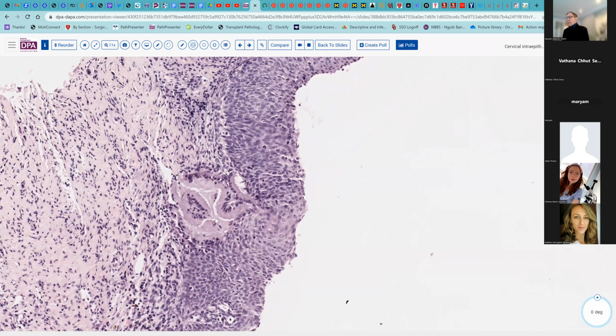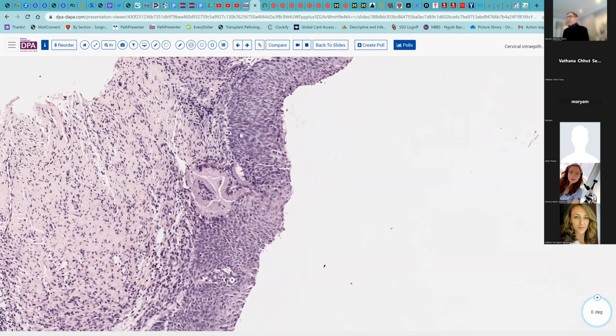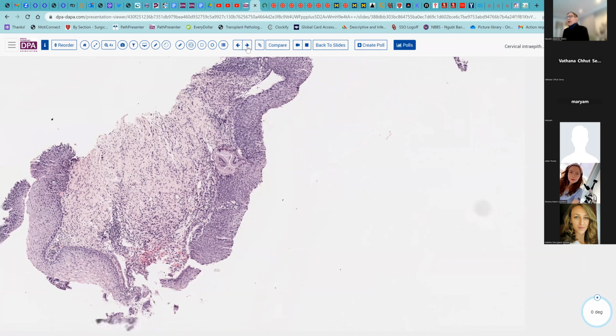Now, in comparison to our earlier case of stratified mucin-producing intraepithelial neoplasia, or SMILE, we see that the mucinous epithelium here is not neoplastic. And so there's no mucin production independently in this lesion. Okay, so we've covered that waterfront. I know that you all see those very frequently.